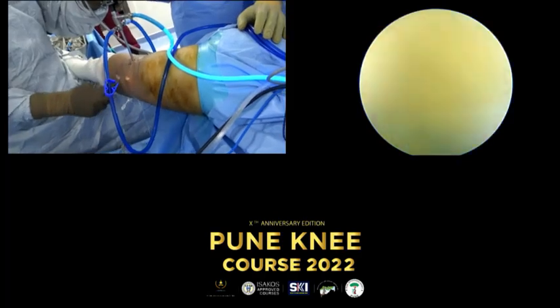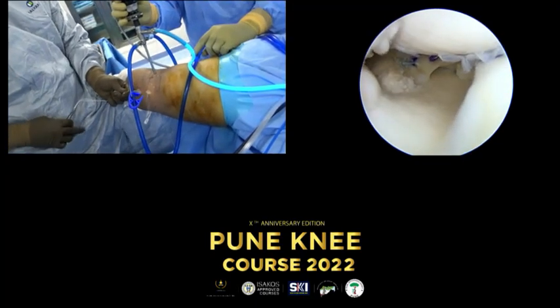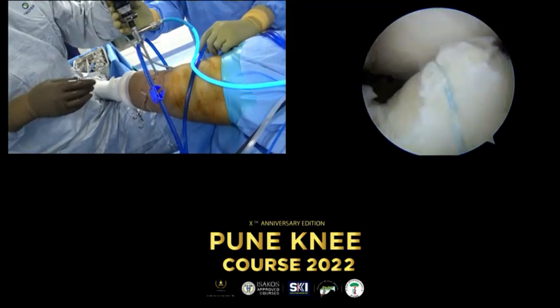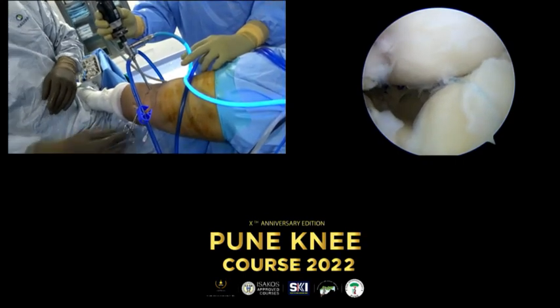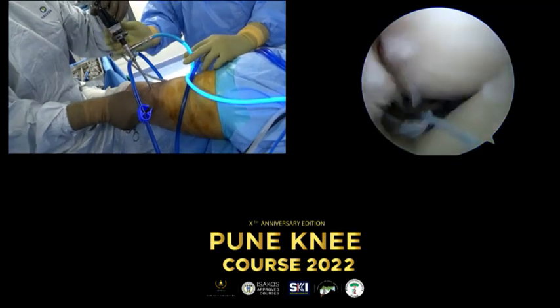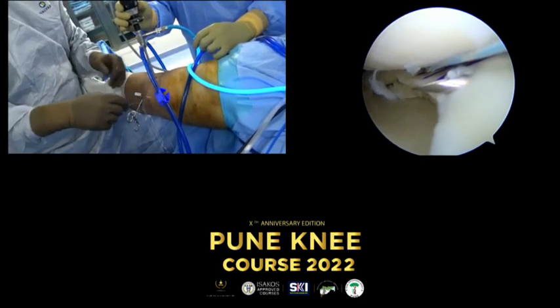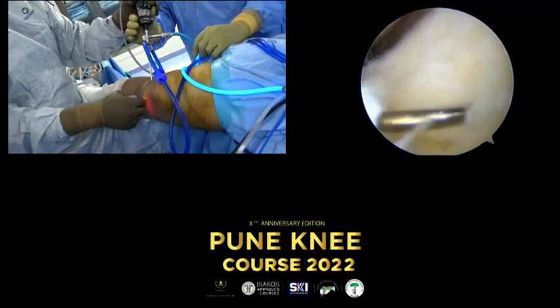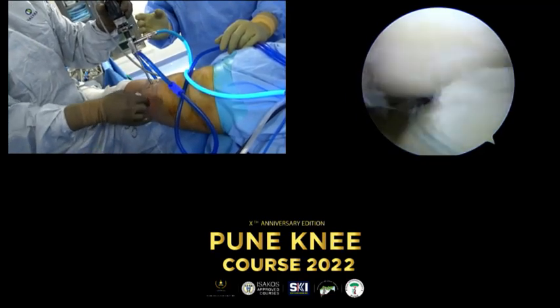Okay, so I was at the anterior horn. Okay, can you hold this? Yes. Let me give me one, is it here? I will hold both horns in place. Outside-in suture. Can you hold this? You want high? Yes, outside high in. No, spinal needles. Two spinal needles. We can work here. One here, another one. Prepare the nylon. So now you'll put in some outside-in sutures in the front, exactly.